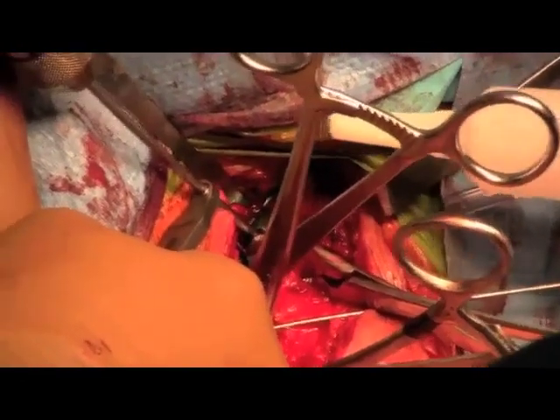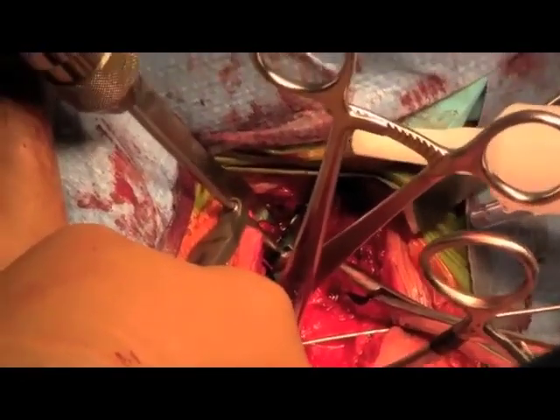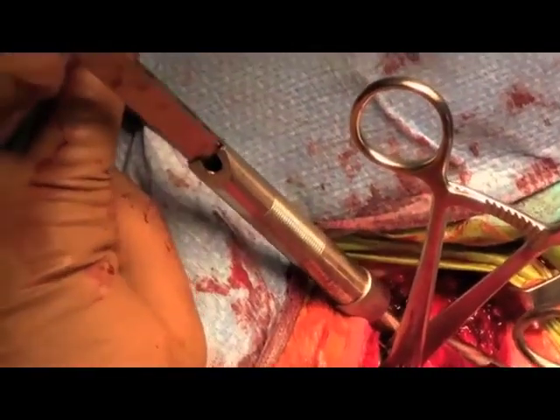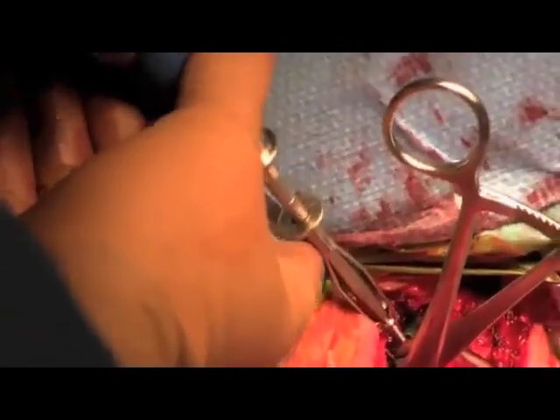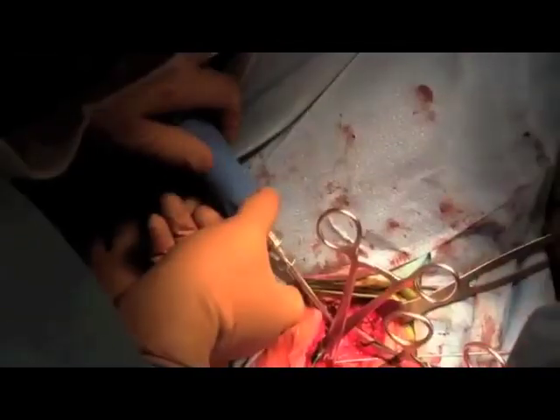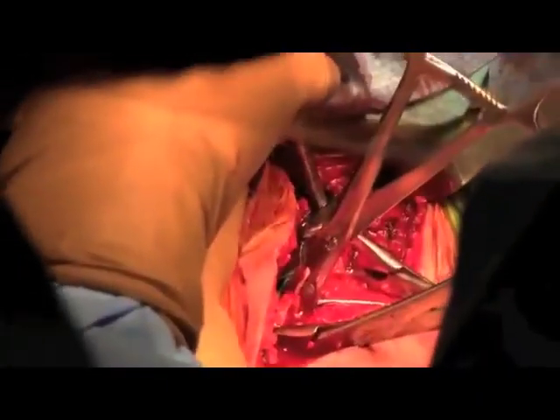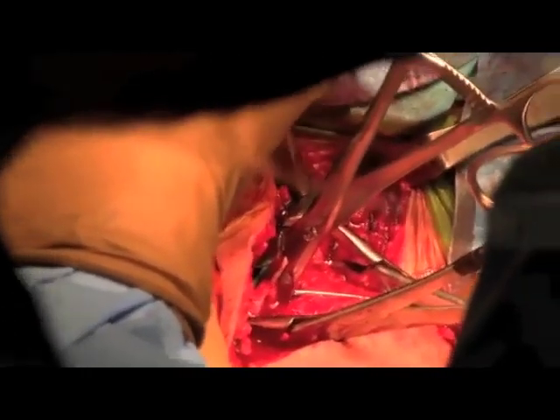Care must be taken to control drill depth past the second cortex to avoid damage to the subclavian vessels and the lung. Drill paths are measured and screws of appropriate lengths are placed in standard fashion. Locking screws are used in this case due to the comminution present in order to improve fixation construct strength.